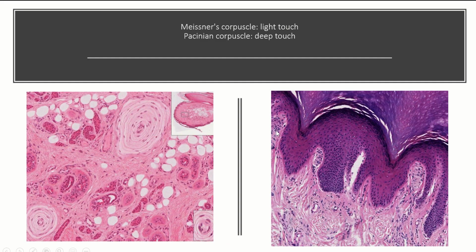Okay, so now we're going to go through some other examples of nerve. We'll cover this more when we cover the skin, but I do just want to show you some examples. So hopefully this is familiar, right? Remember we learned this is all dense, irregular connective tissue. This is that stratified squamous epithelium. And you can see here in this junction between the two, there are these weird looking bundles.